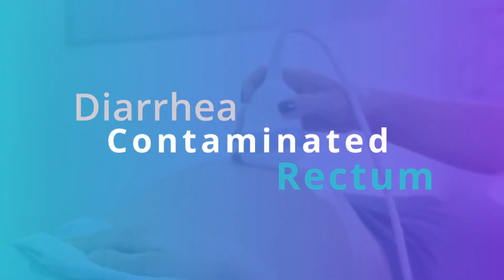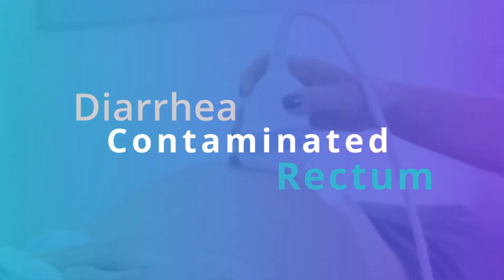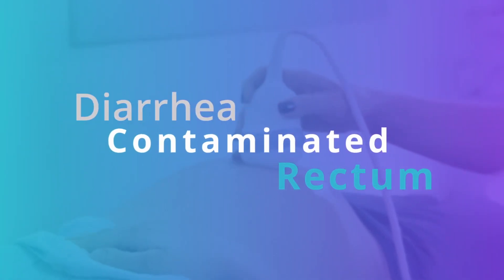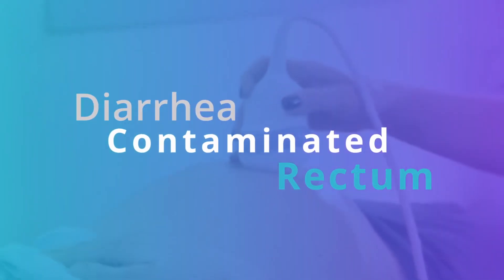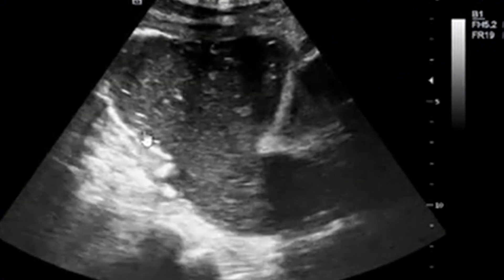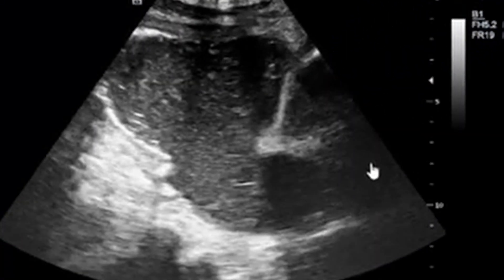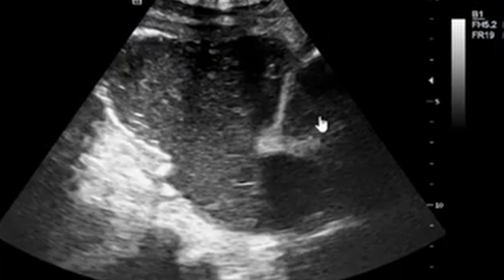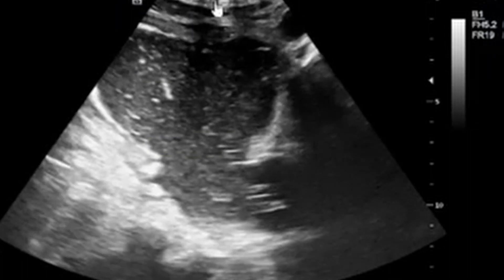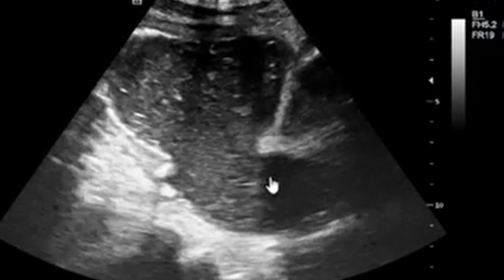In this presentation, I am going to talk about a diarrhea-contaminated rectum or a fluid-filled rectum. You can actually see this distended fluid-filled structure adjacent to the urinary bladder. What we have here is fecal matter that is watery — this is what we call diarrhea.